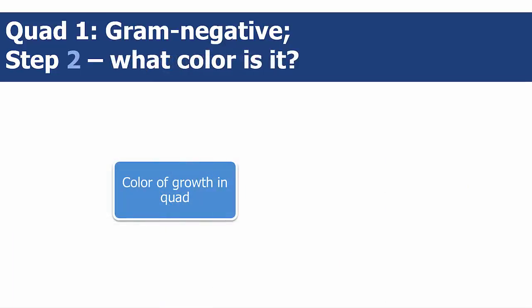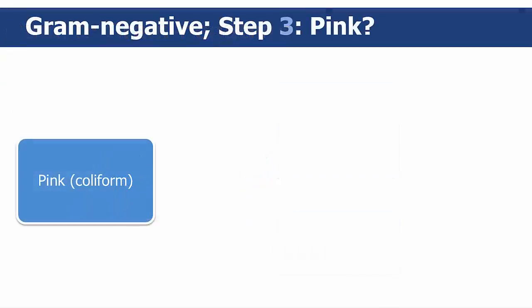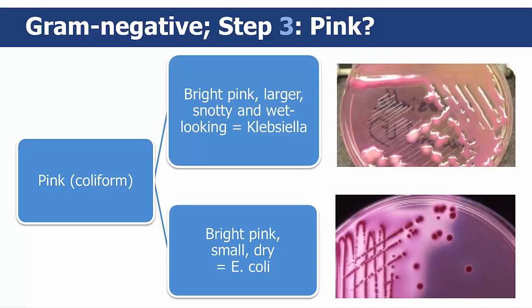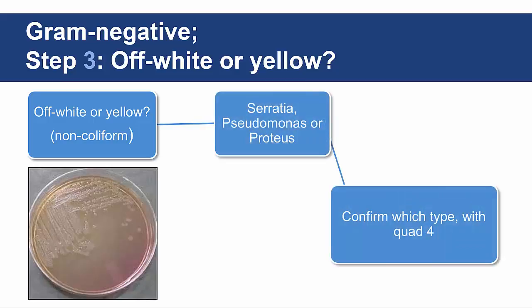In step 2, you'll determine what kind it is based on the color of the growth in the quad. Are the colonies pink or off-white? If the color is bright pink, these types of colonies indicate a coliform type of bacteria. If the color is off-white or yellow, this would indicate a non-coliform type of bacteria, which would be either Serratia, Pseudomonas, or Proteus.